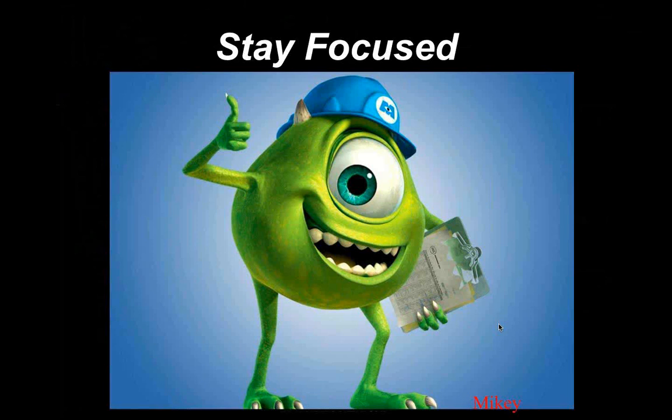And again, your laboratory consultant can help you here in designing these things. If you tell them what you got, what your diagnostic lens was, their parameters, what your over-refraction is, and describe what you're seeing in the way of your vault, your sagittal depth, they can help you out here. And be sure you take a K reading, because if you're getting cylinder, make sure it's not flexure, because it can be misinterpreted as that.